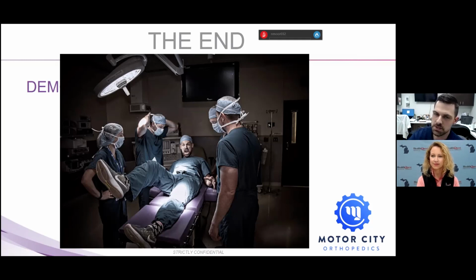I can tell you which ones are easier for me to do and which are harder, when you talk about how thick the palm is and those kinds of things. But I would say anyone that has carpal tunnel should come in, and then we'll do the ultrasound diagnostically and measure you and go from there. If it's equivocal and we need to do nerve studies or more things, we can, or if it's not carpal tunnel, it's something else, we'll treat it that way. But that's how we'll start.